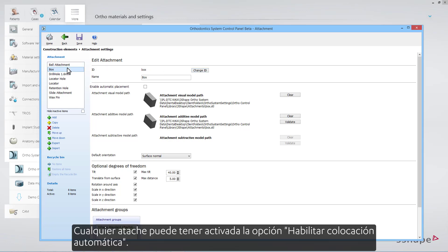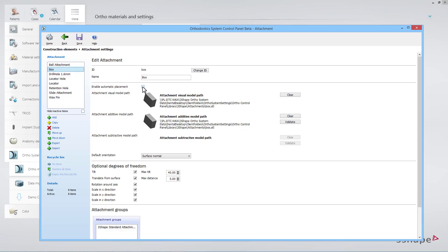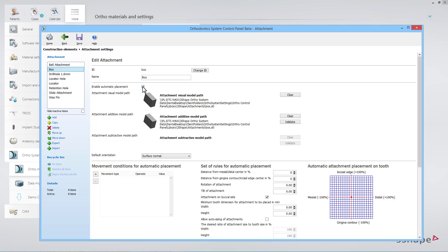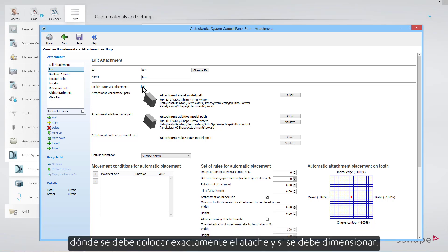Any attachment can have the Enable Automatic Placement option activated. This will open a new section in the control panel for that attachment, allowing you to define under which circumstances the placement rule should be triggered, where exactly the attachment should be placed, and if it should be sized.